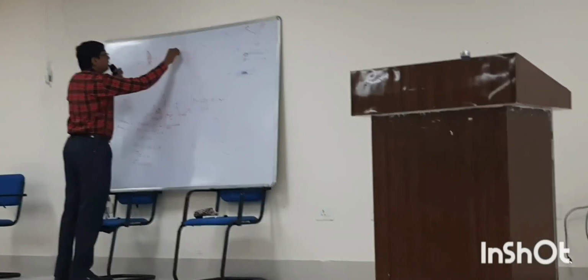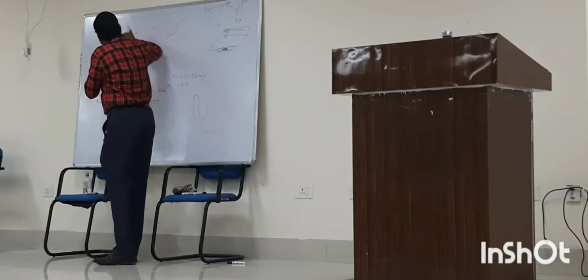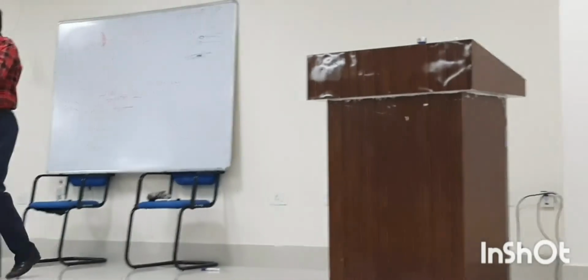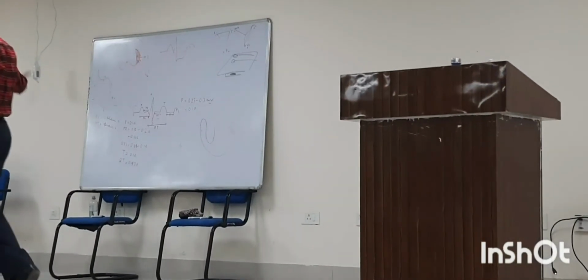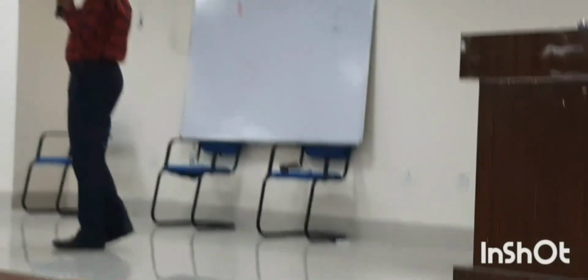The isoelectric point is elevated. There is the R wave. Phase 2 is directed this direction, so ST depressed. In endocardial tissue injury, there is ST depression. In epicardial tissue injury, there is ST elevation.